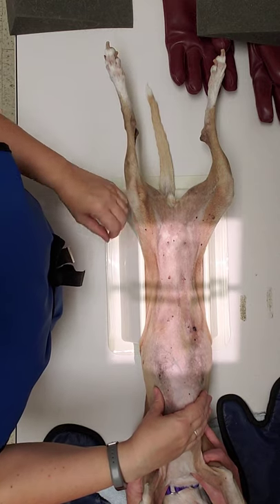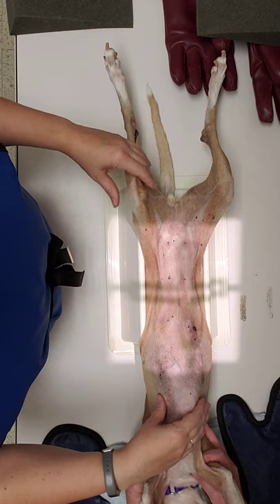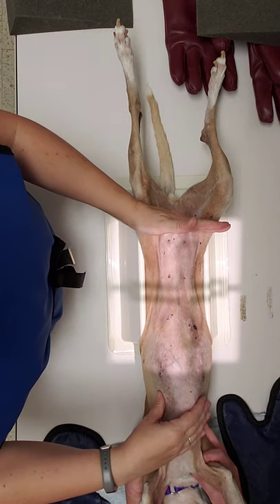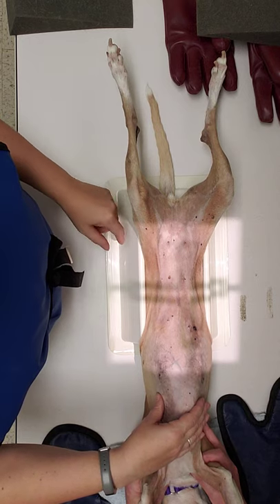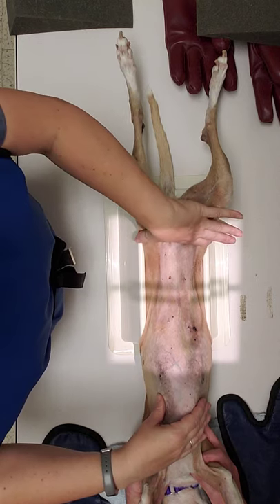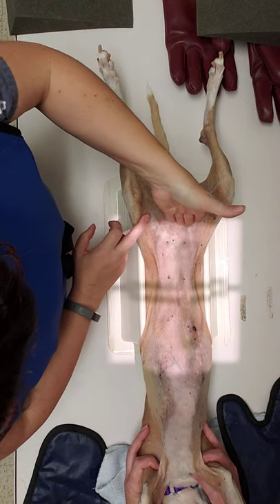You're going to use your V-tray so that you can keep them straight. Your light is going to be collimated to the greater trochanter, which if you feel before you lay her down, that'll be very easy to visualize. If not, just take a look — it's going to be right between her legs, right here.